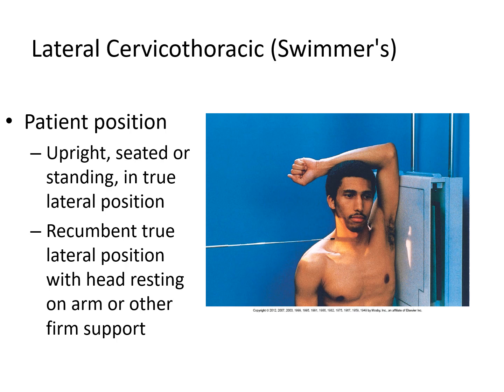I have seen an opposite swimmers when the left arm was injured and they couldn't raise it, and so we raised the right arm and we changed our tube angle radically to compensate for that, but it did not turn out well. Best practice is what you see right here. Closest side is elevated, furthest side is relaxed and or affixed to a weight, so that they're reaching for the floor.